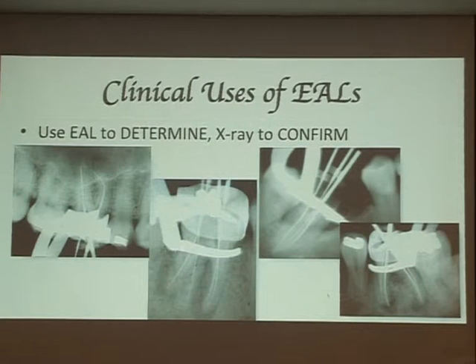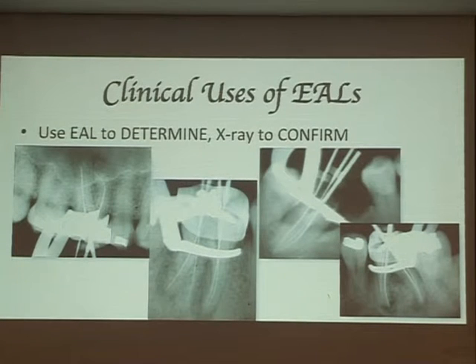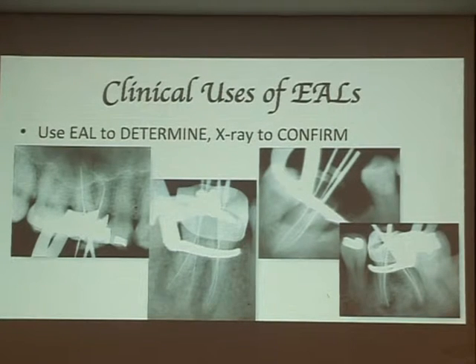Okay, but if I do not take an X-ray for the working length, I will take an X-ray of the master cone, the GP cone. So I need at least 3 X-rays. The first one is before. The second one, you need an X-ray to show the working length, either with endodontic files or the master cone. The third one is after the operation. That's a minimum, okay, by law, a minimum. You can take more than that to help you confirm the working length. But if you take less than 3, you might be in trouble.